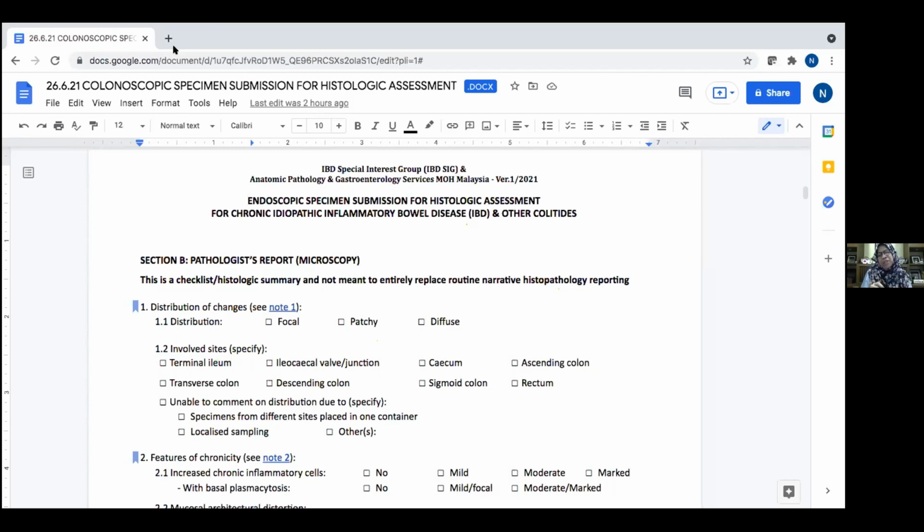If it's borderline, maybe 15 or slightly more than a red blood cell, you may want to make a cautionary note. But I don't diagnose collagenous colitis unless it's very obvious, like the case that I showed. Even though it was patchy and focal, the thickening was very obvious.